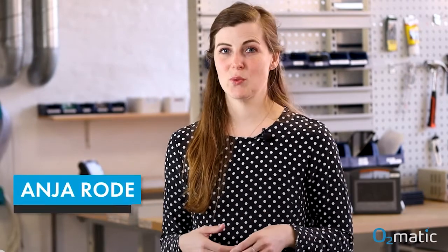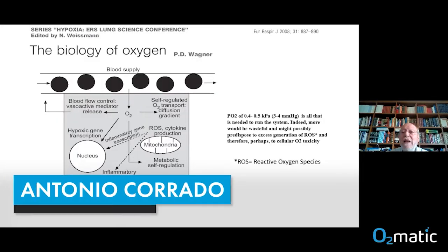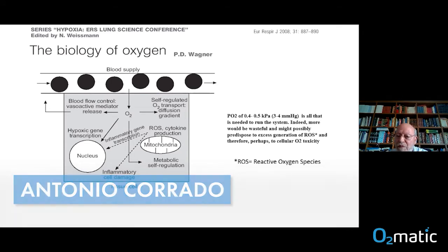In the fall of 2021, we hosted a series of webinars about the importance of oxygen titration and benefits of automatic oxygen therapy. The 3 webinars also covered subjects like pulse oximetry and oxygen therapy during activity. This video will revisit highlights from those webinars. Dr. Antonio Corrado is the former chief of the respiratory ICU in Florence in Italy, and he's an expert in oxygen therapy. To enter the cell, oxygen needs a very little pressure, 3-4 millimeters of mercury.